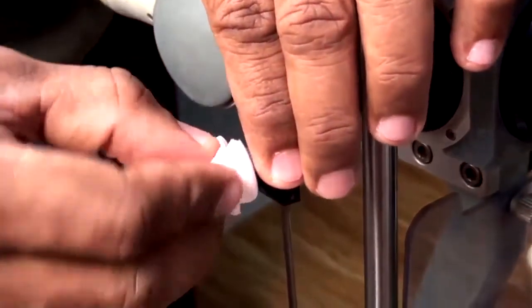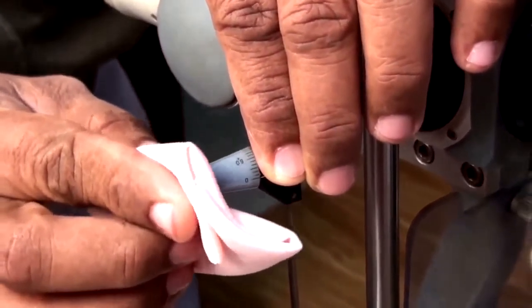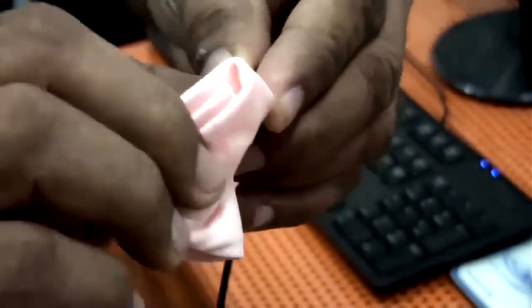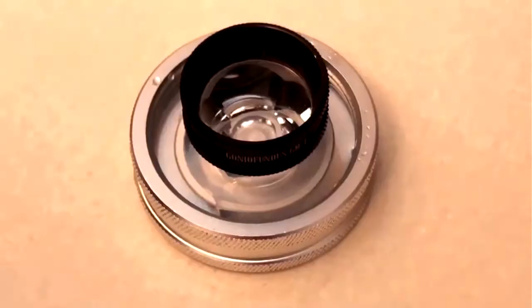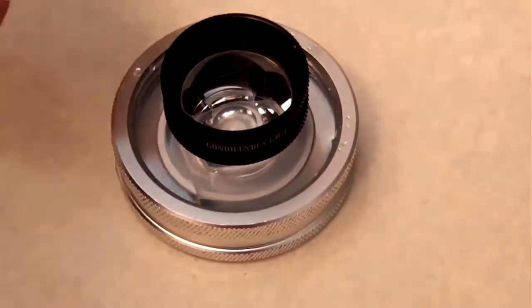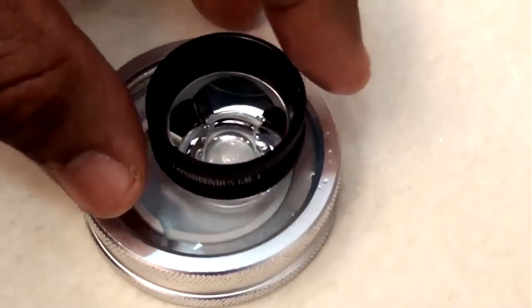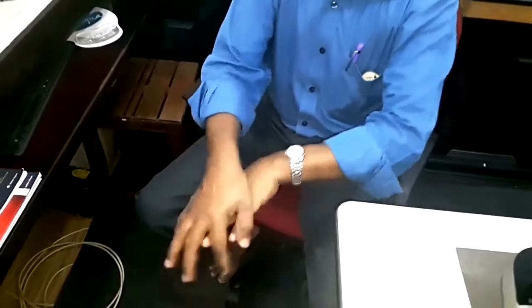The other thing we do is, the tonometer should be cleaned after every contact with the patient. The scan probe should be cleaned. A simple mild disinfectant solution is enough to disinfect. And the three-mirror is one thing which we need to disinfect periodically. The contact lens solution is ideal for cleaning these instruments. And a simple hand wash is not enough. All the steps described by the European norm should be followed whenever we do hand hygiene between patients.